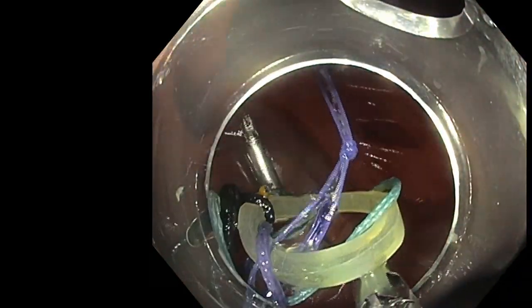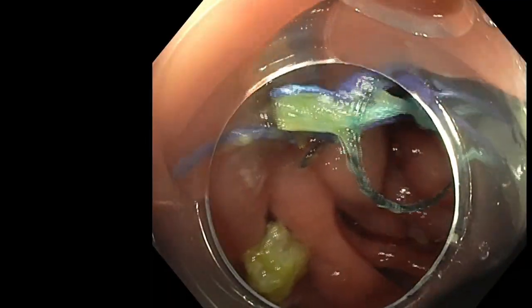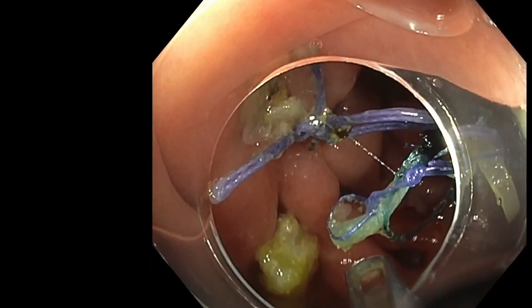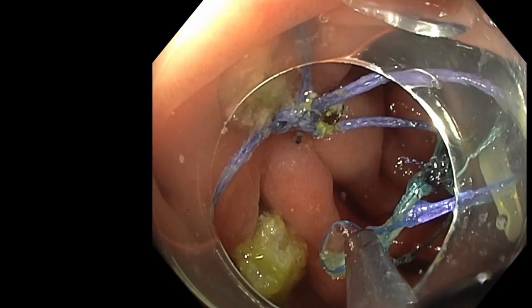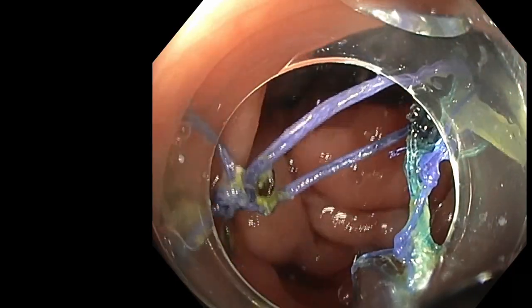In this case, it was difficult to see, so I moved the device in order to see the second small loop, which is here, just in front of us. It's always a little challenging, and we are working on it to reduce the difficulty to catch this loop, which is not so easy.